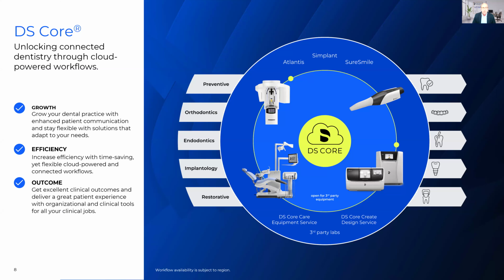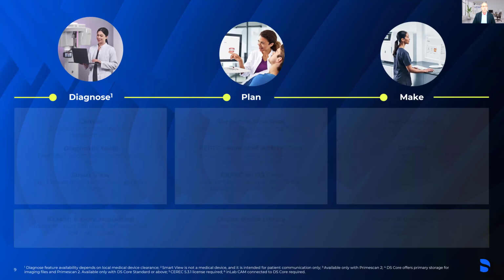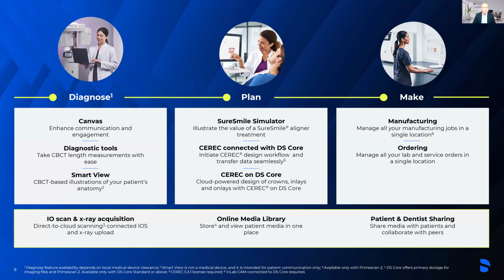And as you can see on the screen here, we have multiple technologies that are being brought in together. And it's also an open platform system, open to third-party equipment as well. So this gives you the ability to diagnose, to plan, and to also do manufacturing. So you can do CEREC manufacturing, or you can do ordering through your preferred lab services.